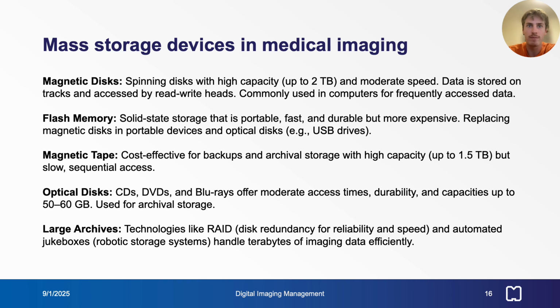In medical imaging, mass storage devices are essential for managing the vast amounts of data generated. Magnetic disks, like hard drives, are widely used for frequently accessed data due to their high capacity and moderate speed. Flash memory, such as USB drives, is portable and durable, but its high cost limits large-scale use.